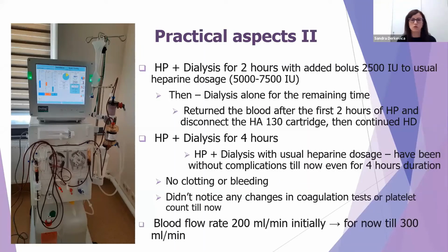But for now we have extended this time for hemoperfusion during all dialysis session for 4 hours, and also we have tried this hemoperfusion with usual heparin dosage and there haven't been complications till now, without clotting or bleeding, and also we didn't notice any changes in coagulation tests or platelet count.